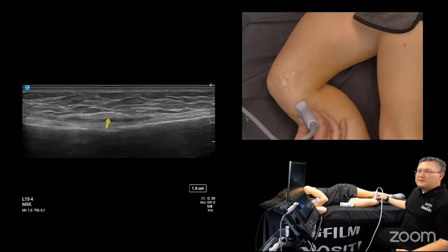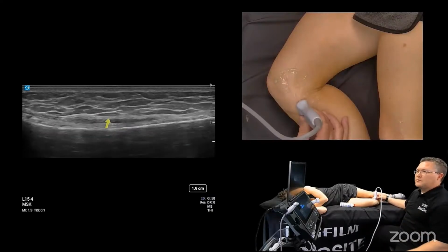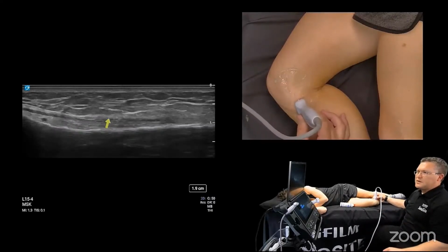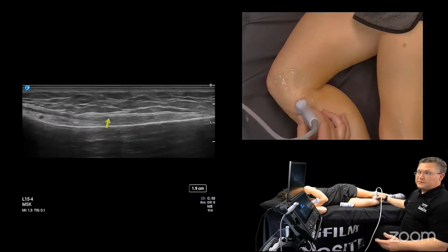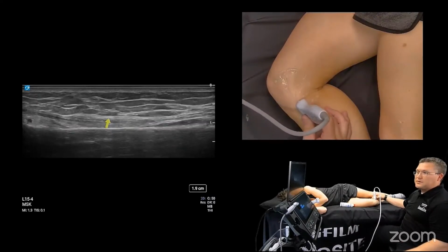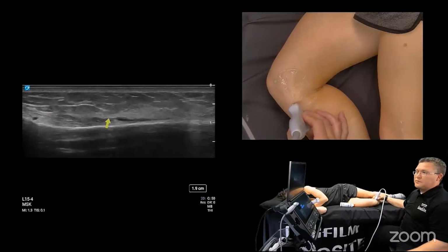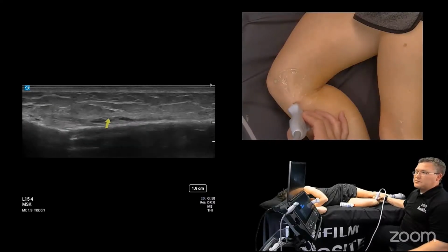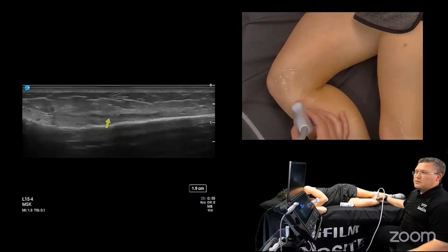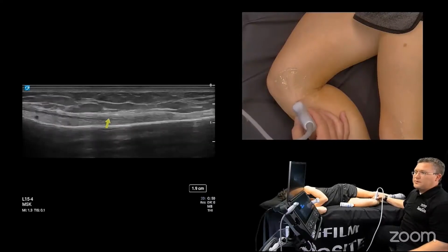And it's a complex. And they really don't show themselves in their isolated pockets of sartorius, gracilis, and semitendinosus. They don't show themselves until there's pathology, really. And in really high resolution machines like this, we can certainly see the delineation between a proximal and distal component. But really what we're looking at is just the overall shadowing structures. Okay, so there we've shown the PES complex and how it's jumping up and over the MCL.